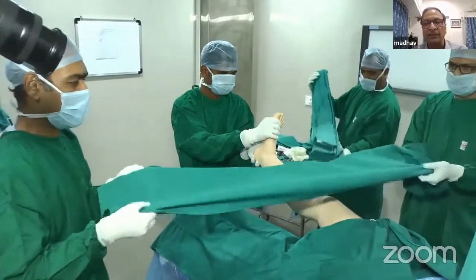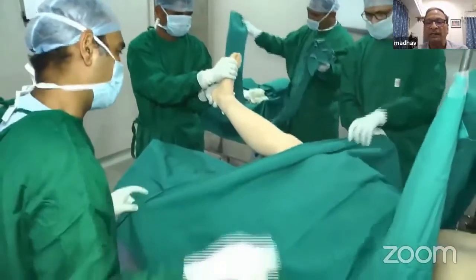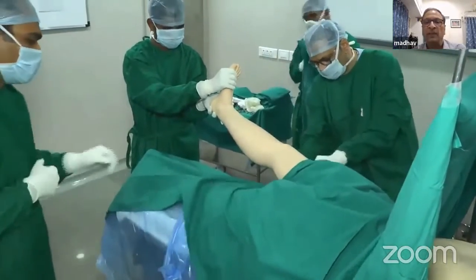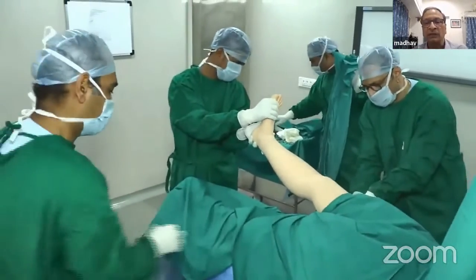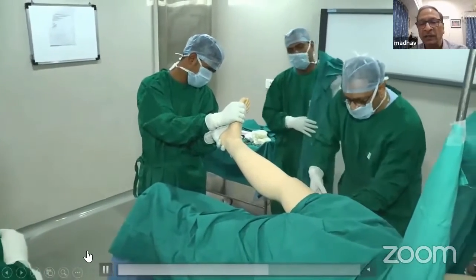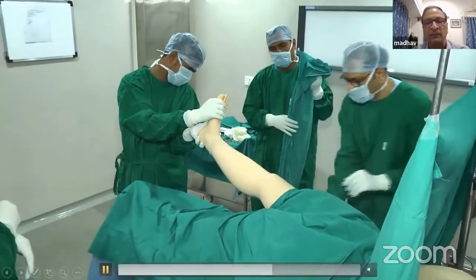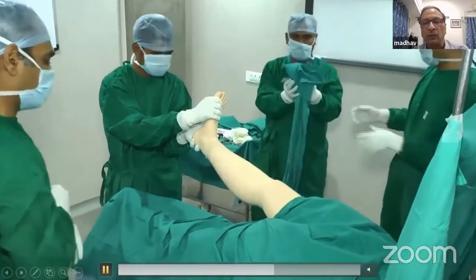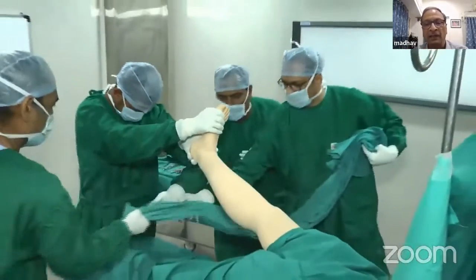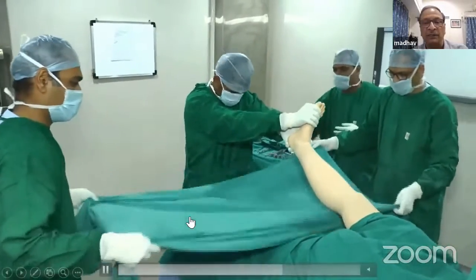Now take a second big sheet and put it on the thigh and the upper body. Take the two ends around the thigh and secure it with a towel clip again, either on the posterior aspect of the thigh or on the lateral aspect. Now you have isolated the upper part of the body and the thigh from both sides, anteriorly and posteriorly.